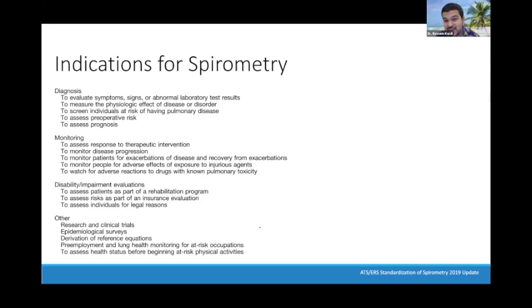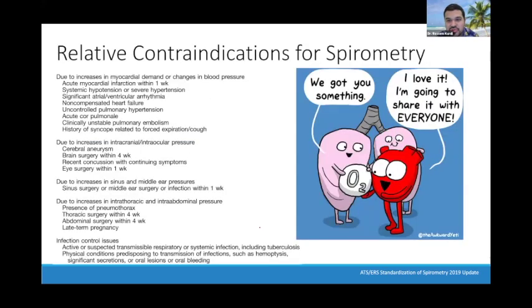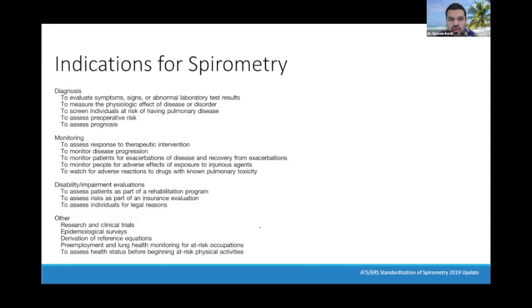Really, anything you can think of from a pulmonary standpoint is an indication. As far as I'm concerned, talking to a pulmonologist gives you all the indications that you need. It's relatively quick and non-invasive. Younger kids will require more time, multiple attempts and more coaching, but they will improve at it. But just to go through it, there's a lot of diagnostic value in PFTs.